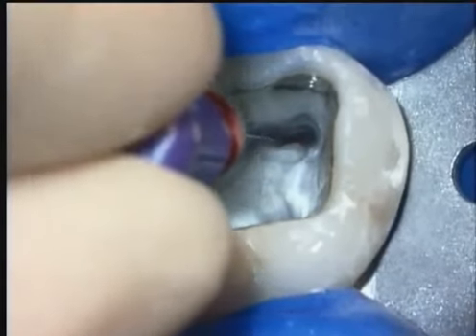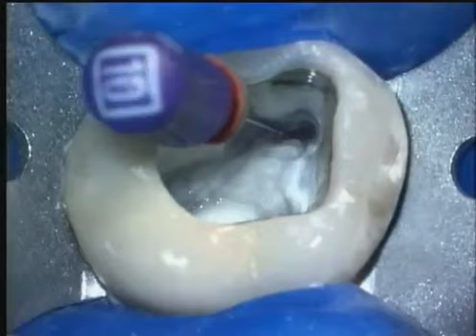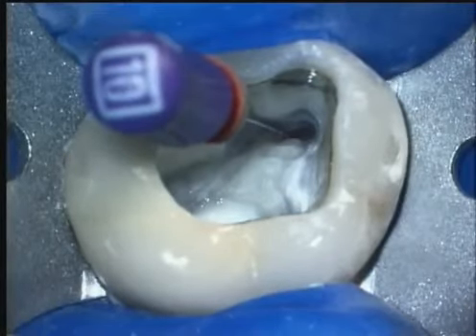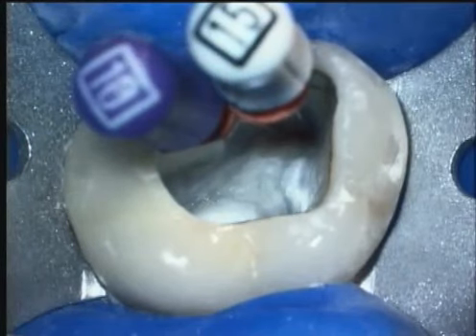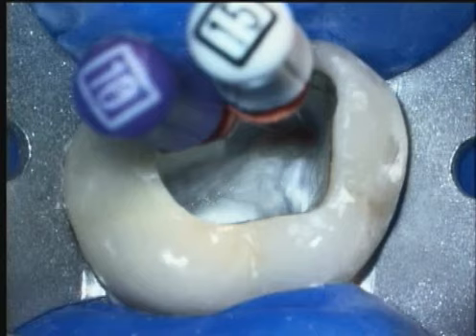Following ultrasonic work, you can see that we've improved access by noting the positions of the handles of the 10 and 15 files standing up straight and tall. We'll look at this case a little later, as the anatomy within the MB root was quite interesting.